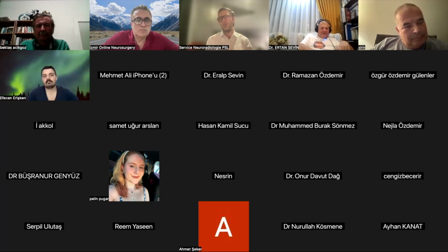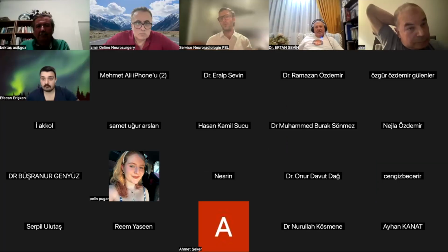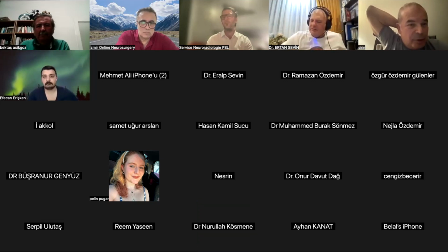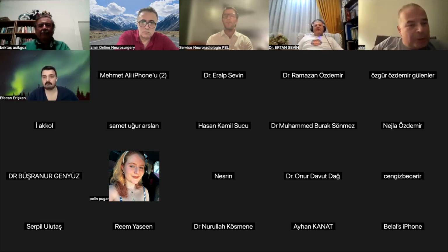And if the lesion is too close to the spinal cord or to the nerve root, we can do a hydrodissection of the epidural space, or we can inject some CO2 to move the spinal cord away from the lesion and to insulate, I would say, the spinal cord and avoid thermal lesion. But you do not see the whole, for example, axial cut, let's say, you don't see all the thermal effect in the prevertebral area, paravertebral area. You just monitor the epidural space.